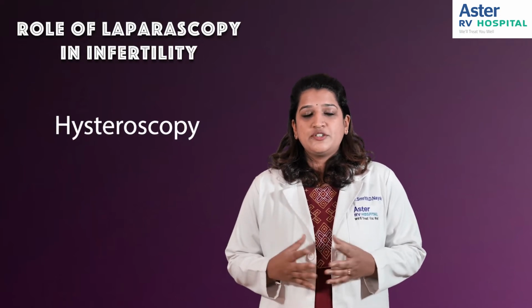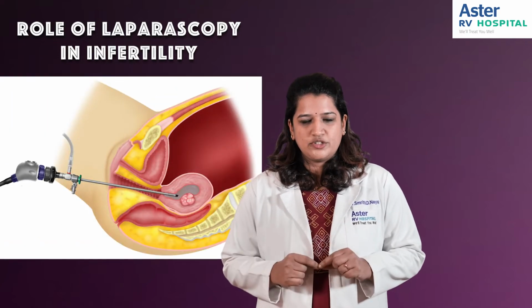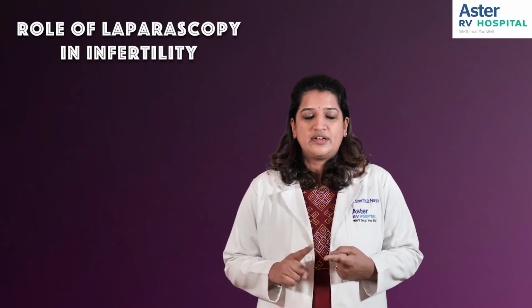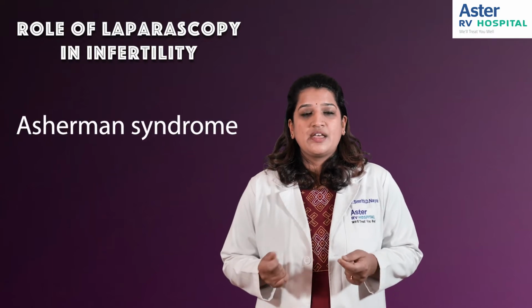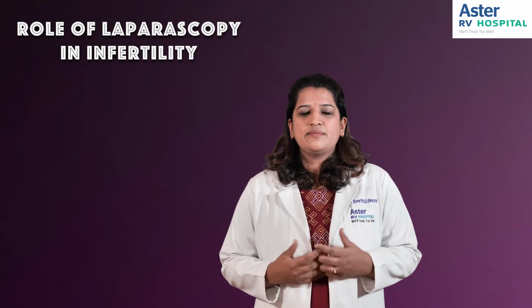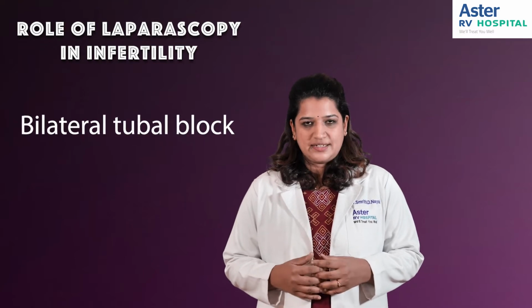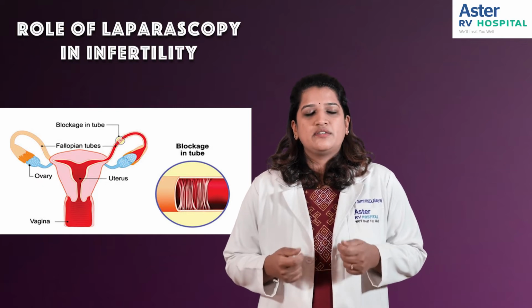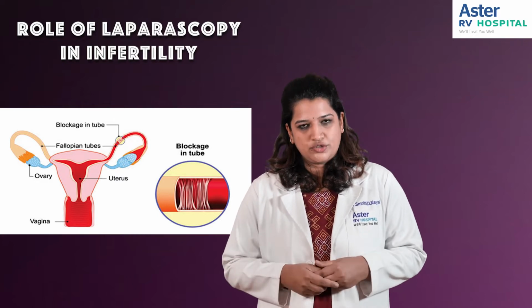Hysteroscopy. Hysteroscopy is a small procedure where we will be inserting a camera inside the uterus to visualize the uterine cavity. In conditions where there are adhesions, it's called Asherman syndrome. The adhesions are cut. This is a very common cause for inability to conceive. The second most common indication is bilateral tubal block. In this condition, the tubes are cannulated and tried to be opened when the tubes are blocked at the beginning of the insertion of the tube to the uterus.